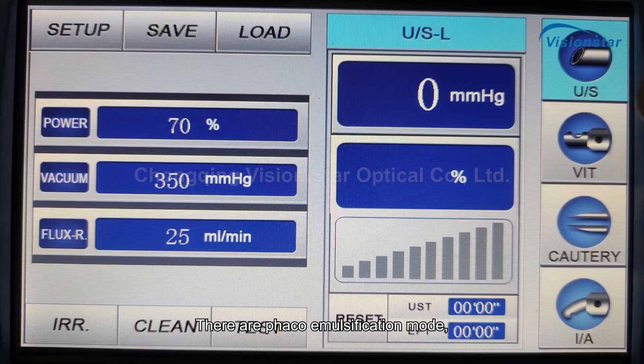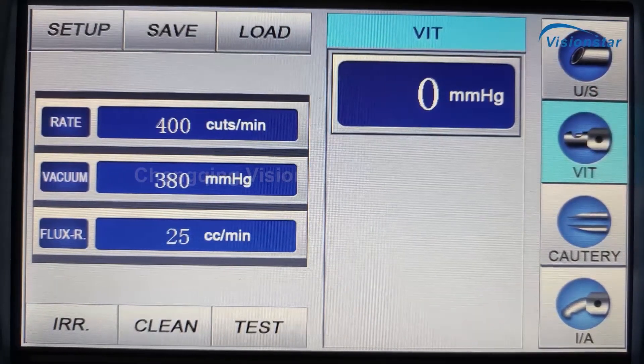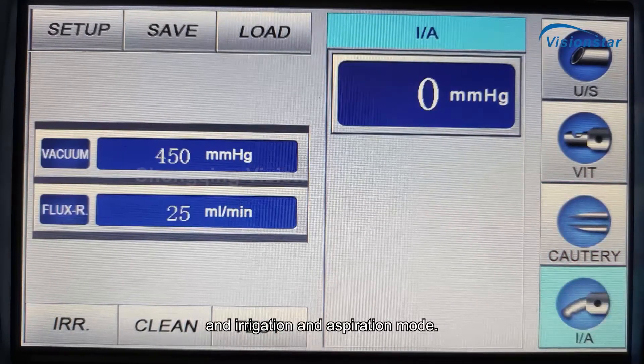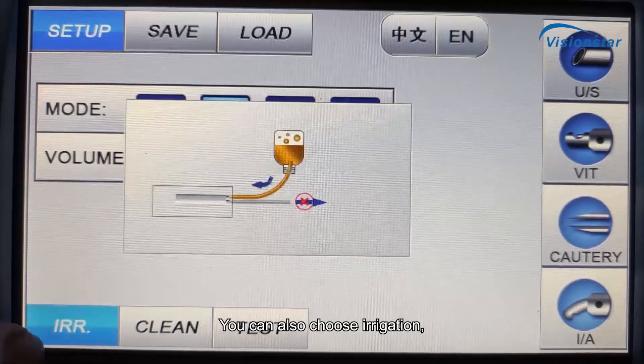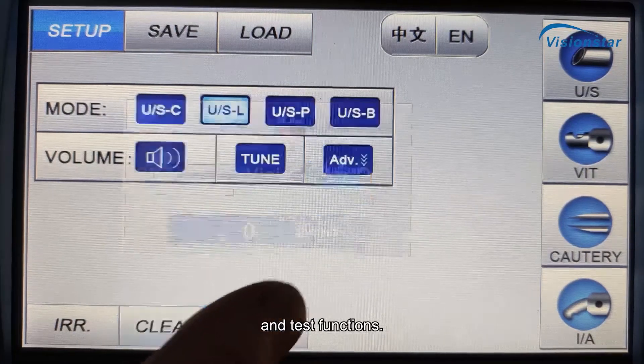There are FACO emulsification mode, vitrectomy mode, cautery mode, and irrigation and aspiration mode. You can also choose irrigation, clean, and test functions.